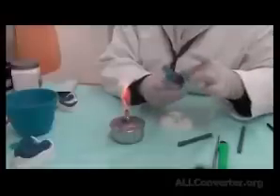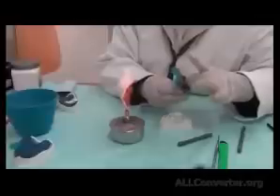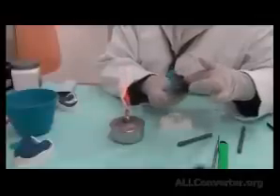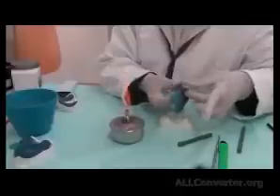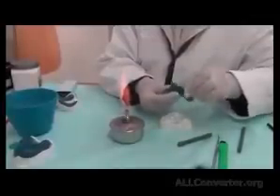I cool it a bit with warm water and begin manipulating it with my fingers, making sure anything that went to the fitting surface, I'm pushing it out. So the fitting surface is clear, minimal amount of green stick is there. And on the buccal side, there is no excess. And it's ready to be put in the patient's mouth.